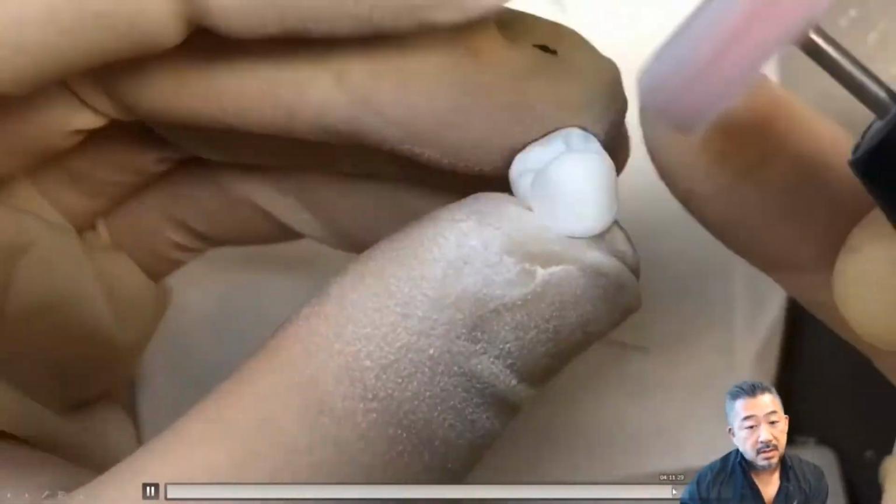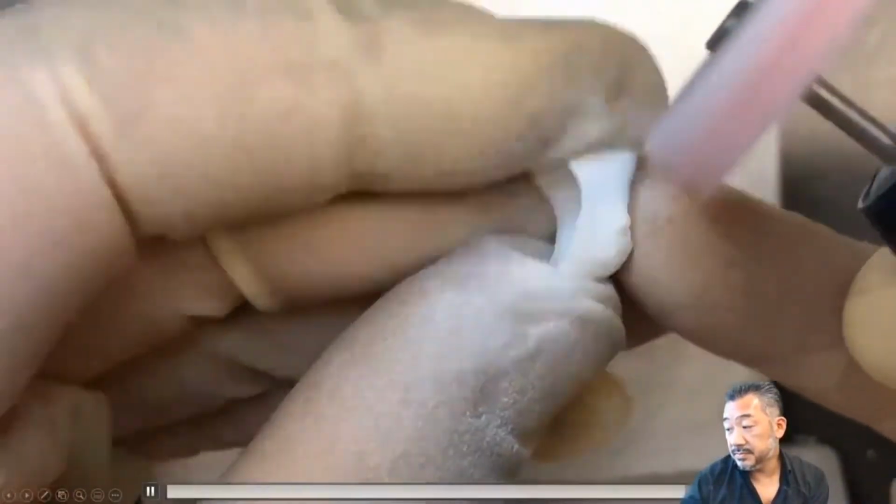And at the end, brush off and clean if it's possible.